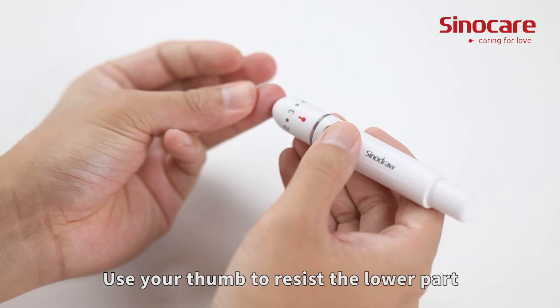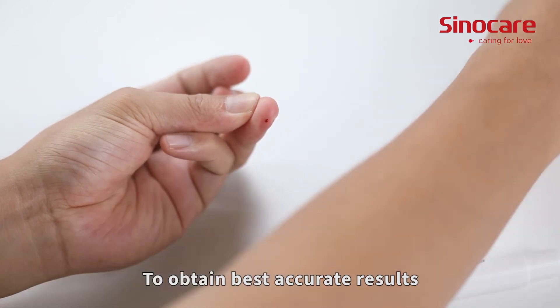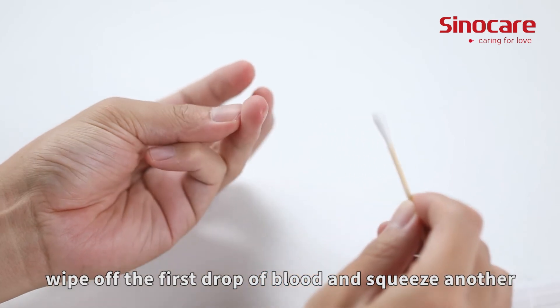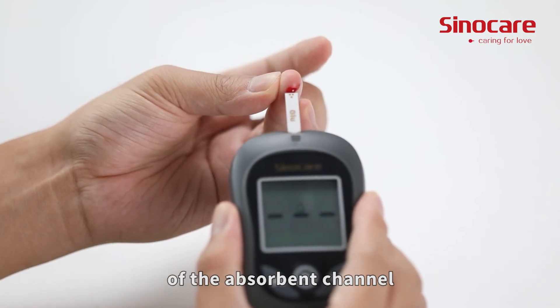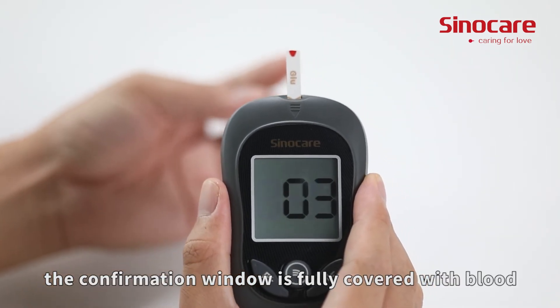Use your thumb to resist the lower part of the puncture device to help the blood draw. To obtain the best, most accurate results, wipe off the first drop of blood and squeeze another. Apply the blood sample to the opening of the absorbent channel of the test strip until the confirmation window is fully covered with blood.